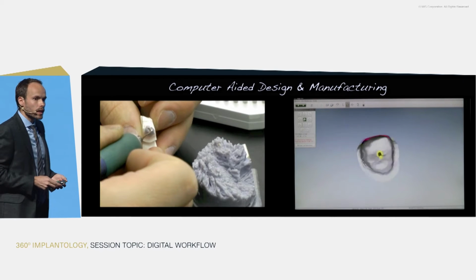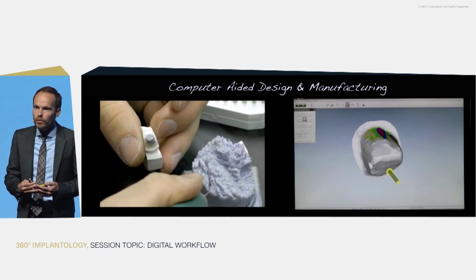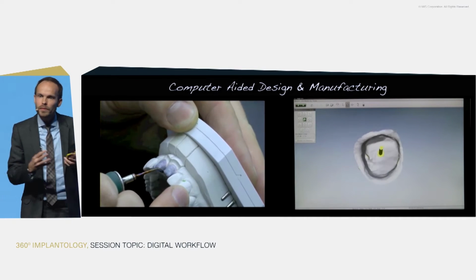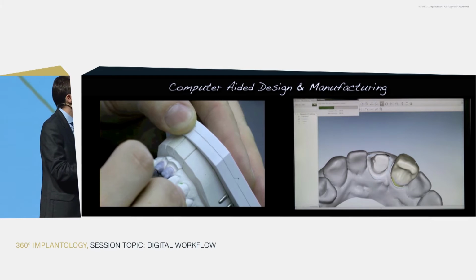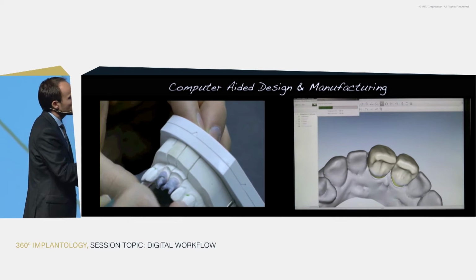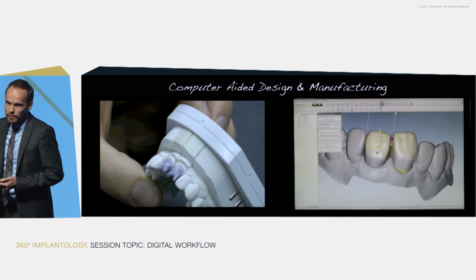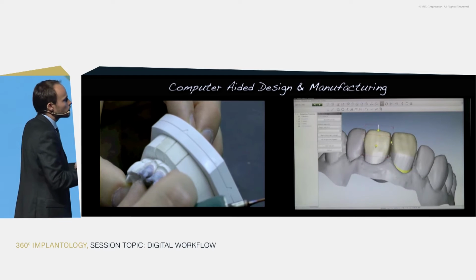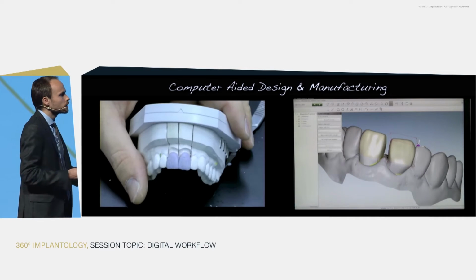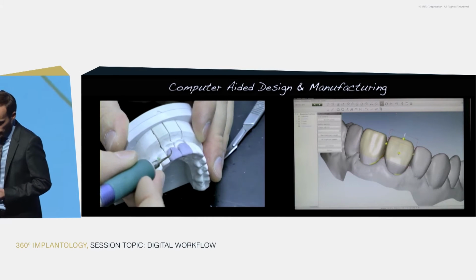On the other side, in the digital approach, I immediately ask the software out of the library to give me 2 crowns, and within the first 10 to 20 seconds I take care of the correct shape according to the patient's smile and the patient's demands. Is it a square shape, diastema, maybe more round teeth, more triangle? Immediately we are with the design for the patient.